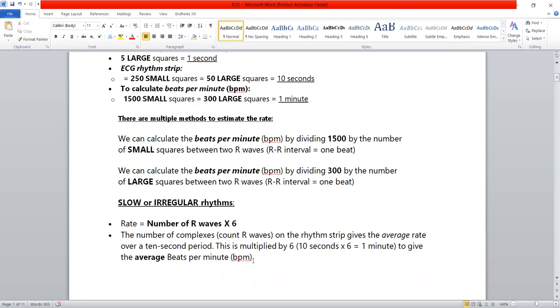The rhythm lead is usually 10 seconds long. For an irregular rhythm, we calculate the number of R waves in a 10-second strip of 50 large squares, then multiply that number by 6 to get the heart rate per minute.